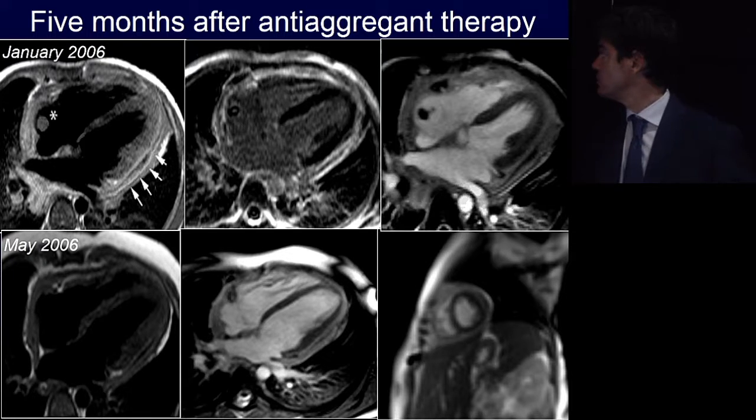but what happened here? Look at the septum. Look at this, let's say the apical part of the septum. I will indicate it.